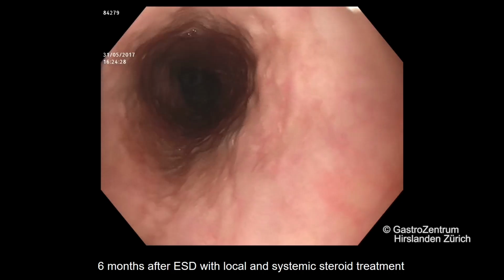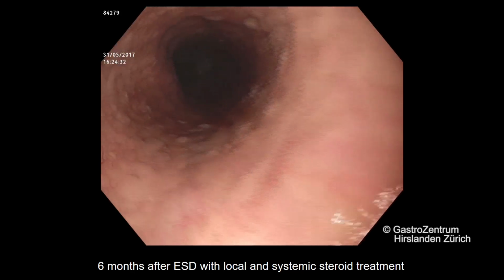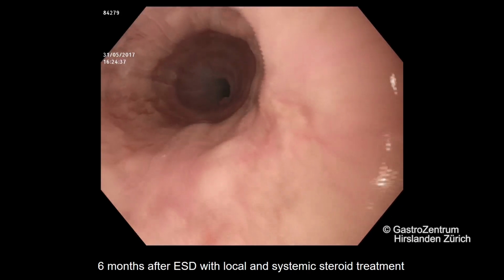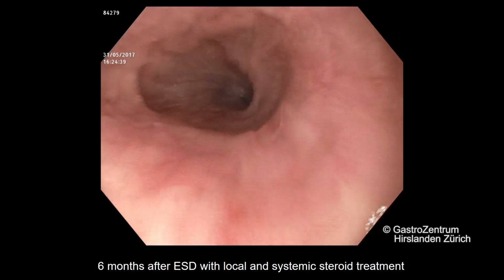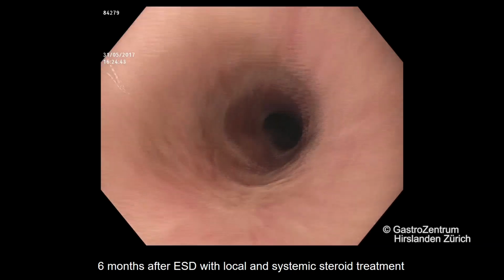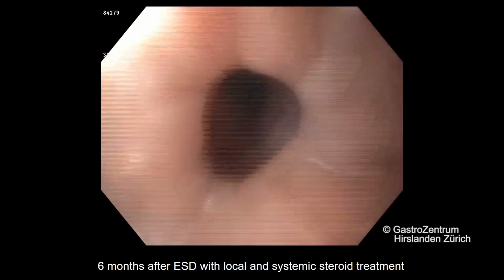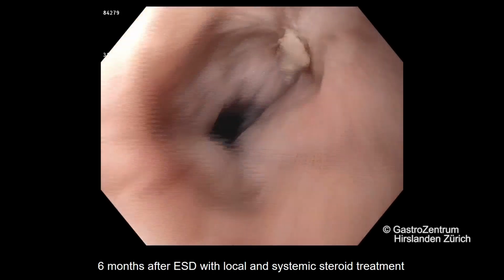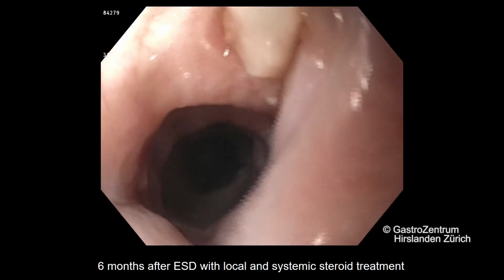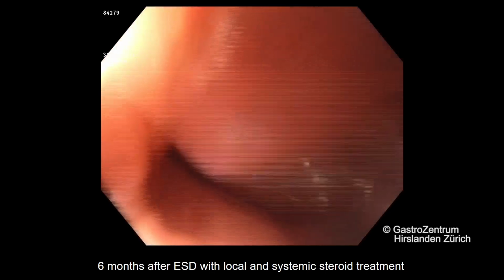I think we also have a video, because maybe you don't believe this. But finally, this patient did not develop a stricture. We have told the patient several times that there is a clear indication for surgery. And now, when the complete area has healed after the ESD, we will discuss if radiochemotherapy would be an additional option for this patient. This is the follow-up of the patient.